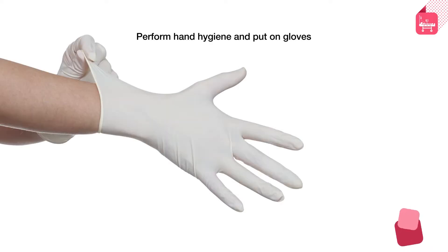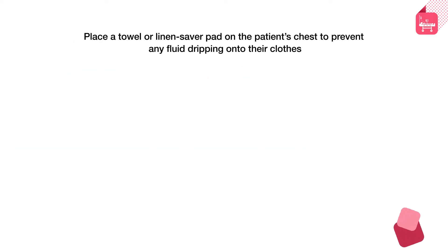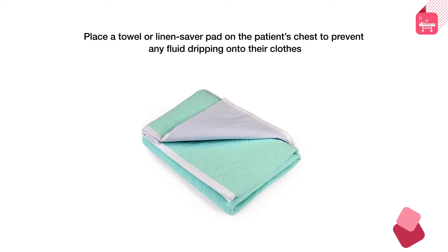Perform hand hygiene and put on gloves. Place a towel or linen saver pad on the patient's chest to prevent any fluid from dripping onto their clothes.